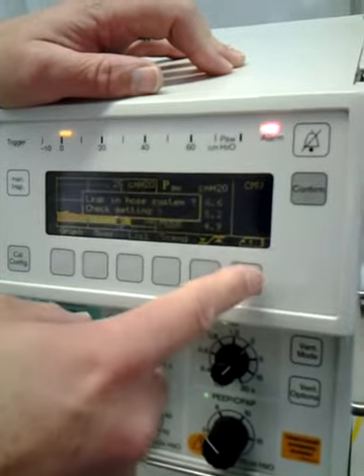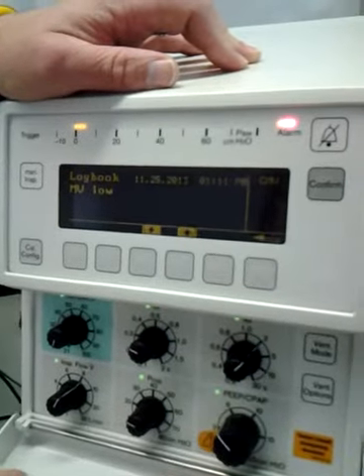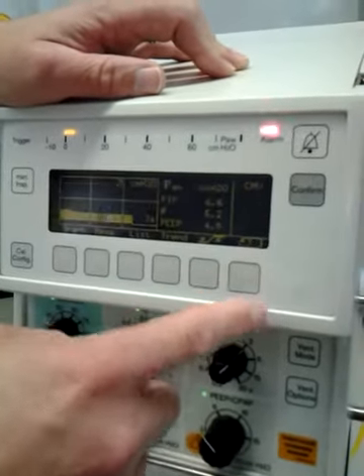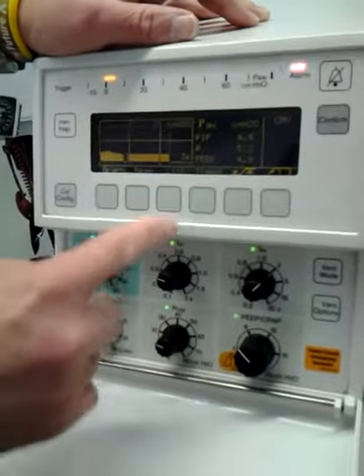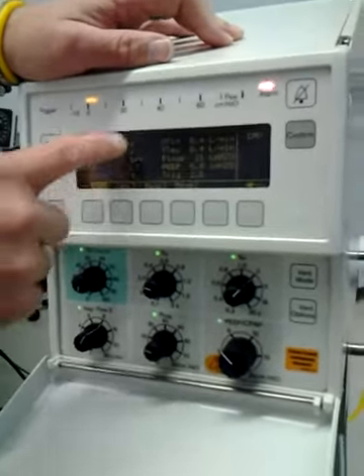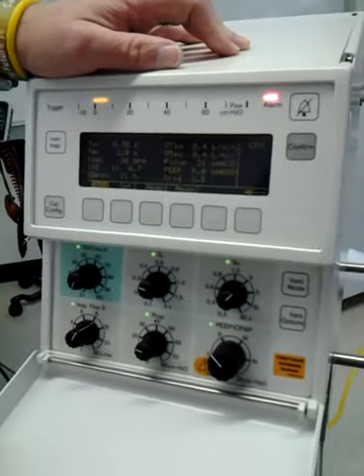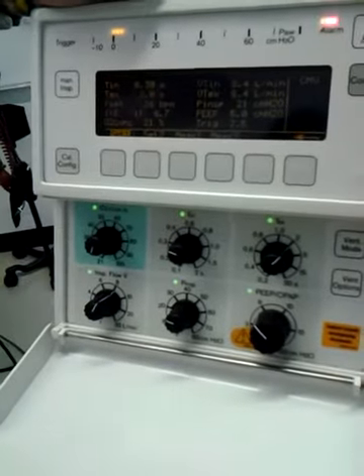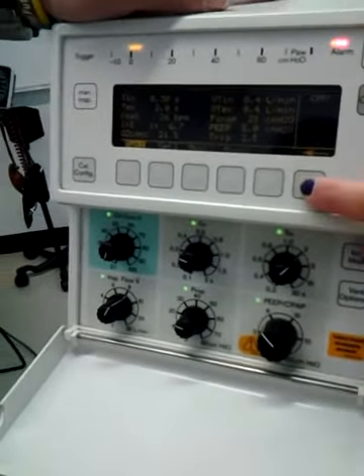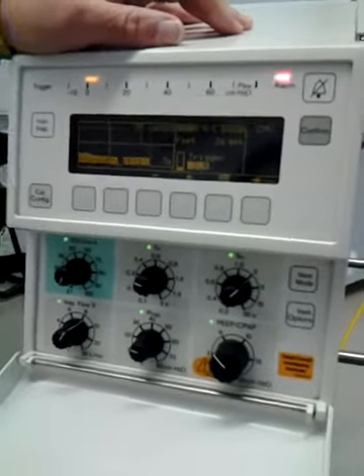Is there a trigger setting? Yeah, it says on there. Sensitivity? Yeah. So list is equal to that main screen. List is going to take you to everything that's here. How do you change it? I think what's built in is 2.5. It's all our vent modes, and you want something in assist control. That's where the trigger set is.